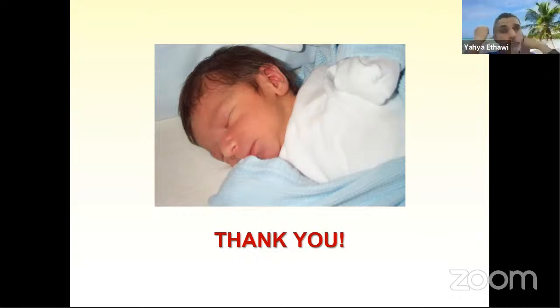Have you done it yourself? Oh yeah. We have extubated, especially the tiny babies, because you don't really want to expose those babies to a conventional mechanical breath. And again, what you can do is a 10, 15 minute or half an hour PSV trial, in which you go from the jet to PSV VG mode, with a very low backup rate, to see the baby breathing on top of it, breathing 30 or 40 at least. So in half an hour, if you switch and the baby's not breathing, well, you know he's not ready to be extubated. Oh, okay. We have extubated babies straight from the jet. Oh, okay. Thank you very much.